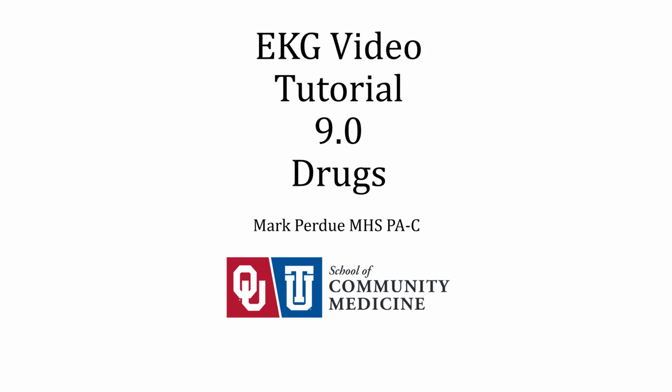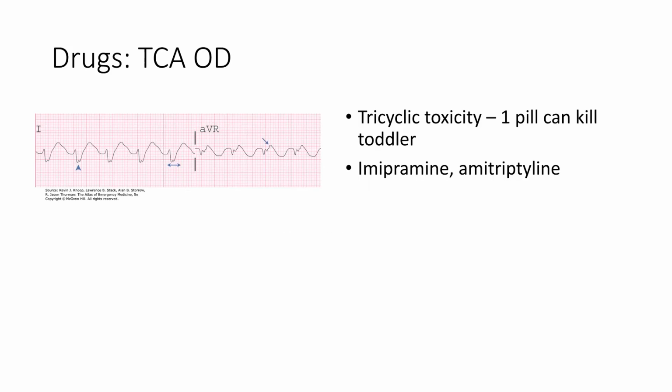In EKG video tutorial number 9, we are going to briefly review 3 drugs that are associated with electrocardiographic changes in the setting of toxicity. The first medication toxicity we're going to review is tricyclic antidepressants.